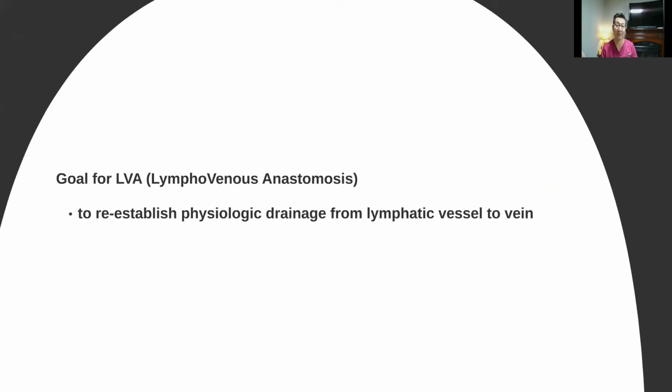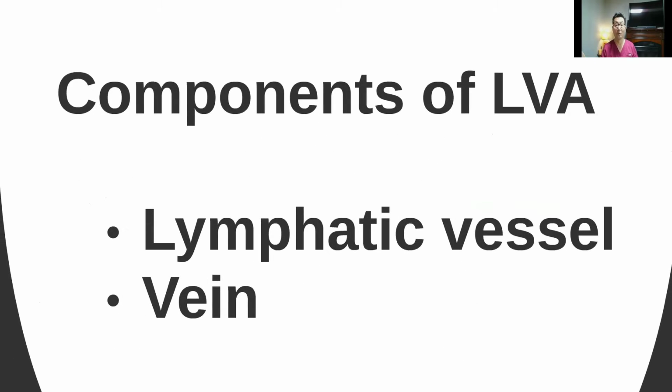lymphedema surgery. Now, the goal for LVA is to basically reestablish the physiologic drain from the lymphatic to the vein. So the main components of the LVA are the lymphatic vessels and the vein.